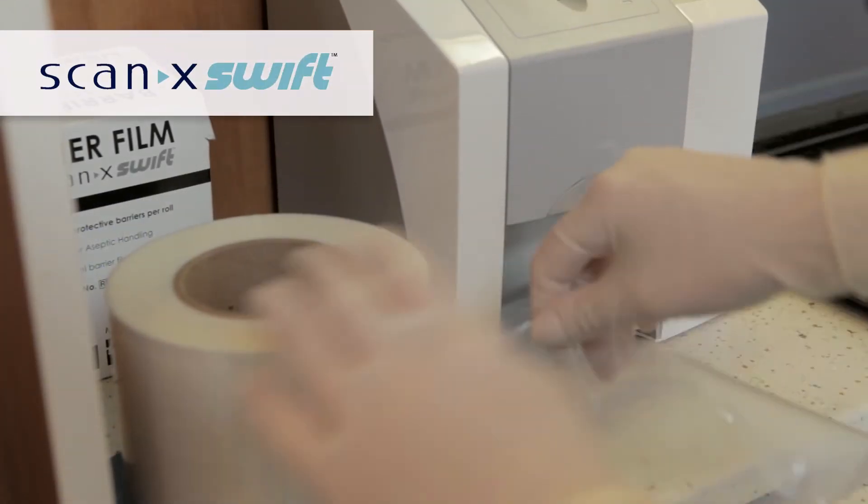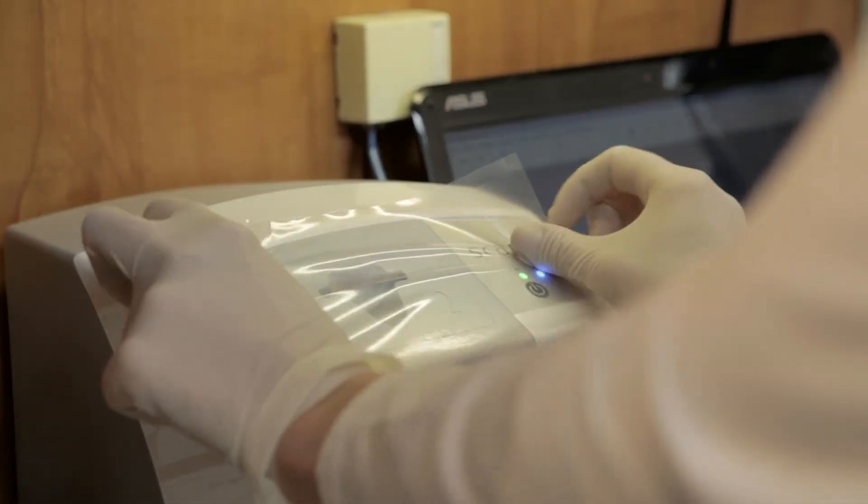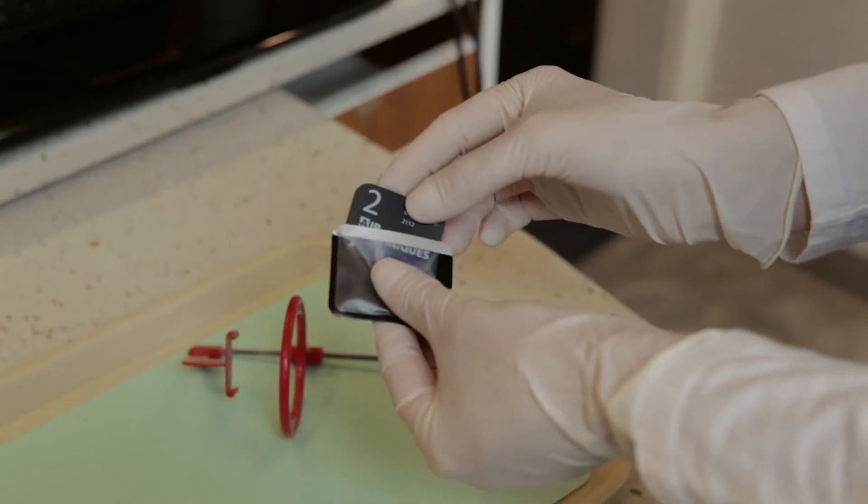Starting with the ScanX Swift, place a new barrier film sheet on the Swift and ensure that it covers the buttons and the slit is over the slot of the plate guide. Insert the ScanX sensor into the barrier envelope.